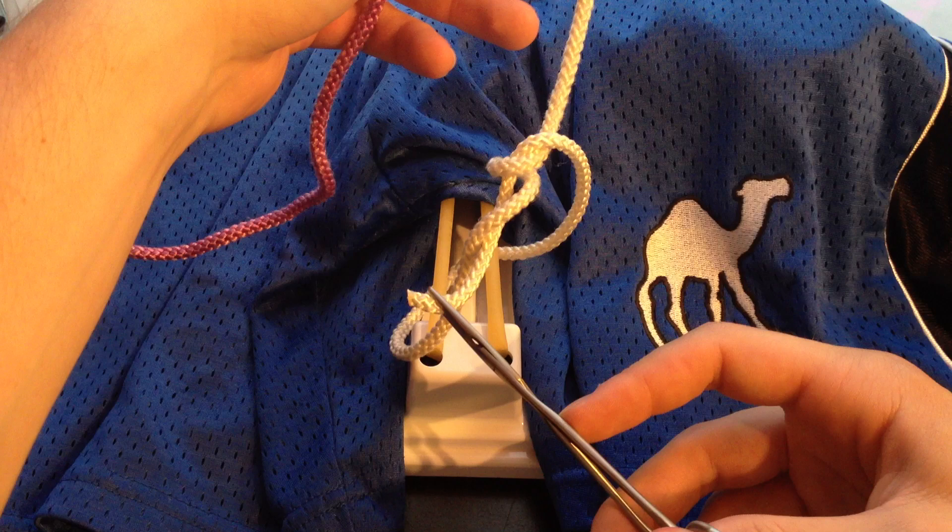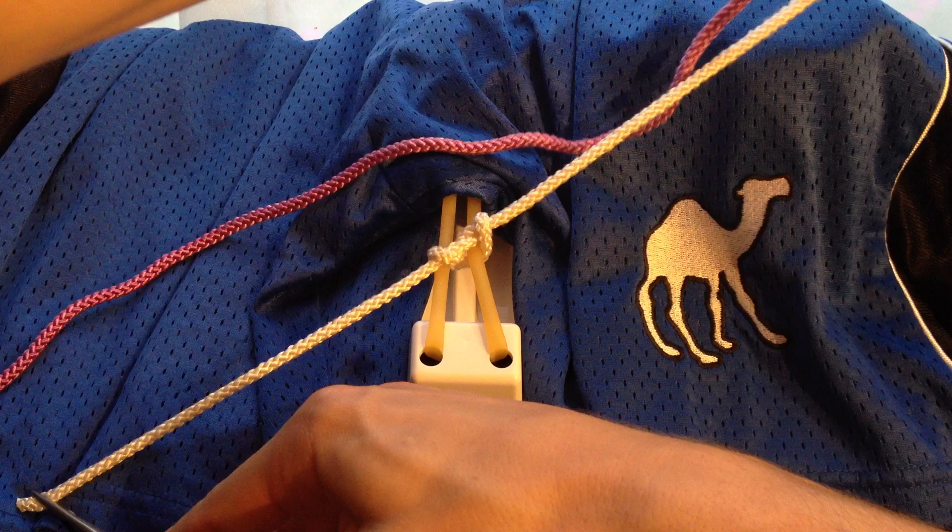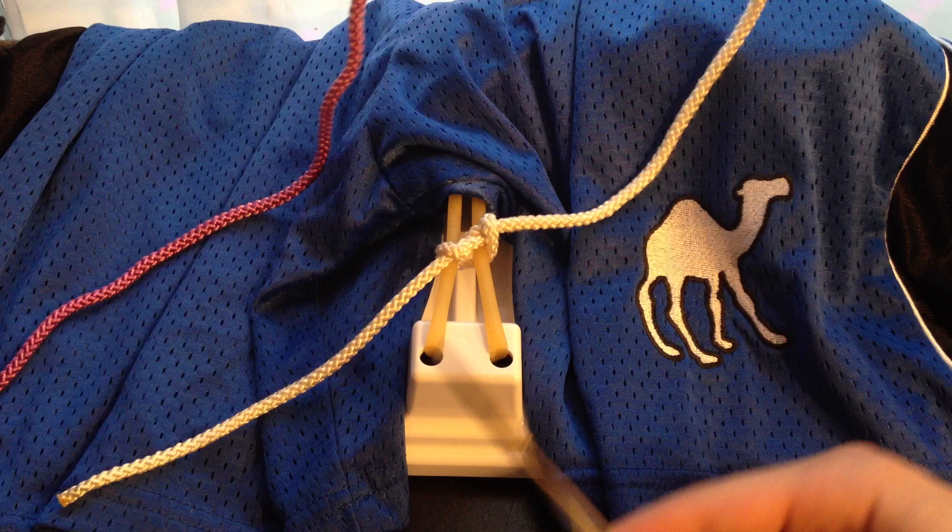I'm just going to have to work it through with my fingers. There we go — that's our first knot. When you pull it tight, you're going to pull the short end in the opposite direction from where you grabbed it. I picked it up on the right side, so to pull it tight, I'm going to pull it over to the left. And there we go — that's our first knot.